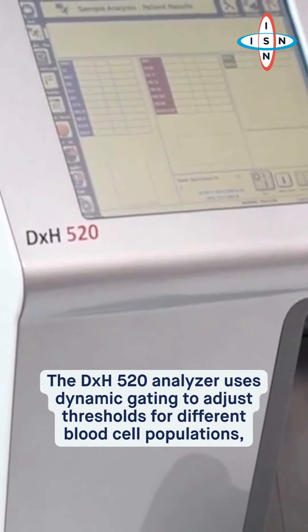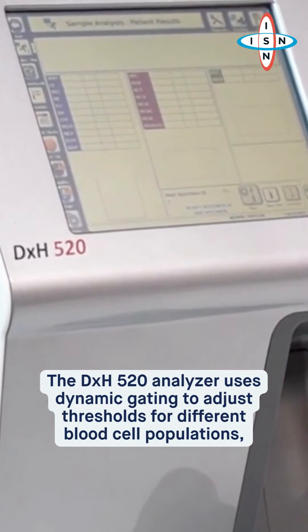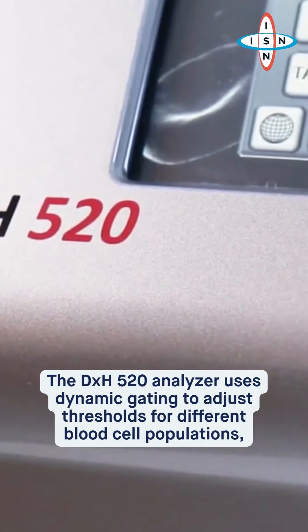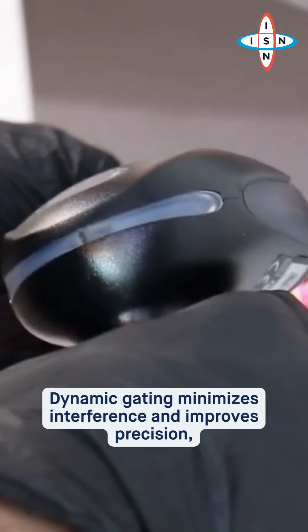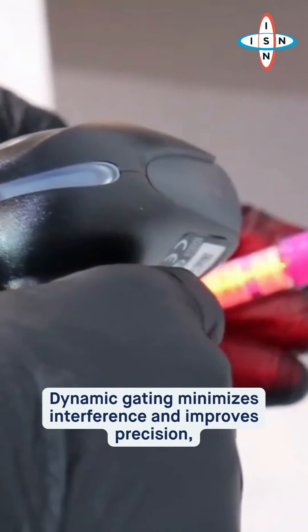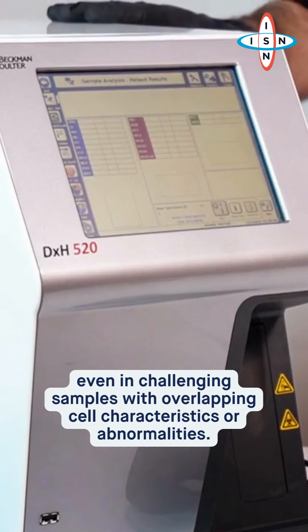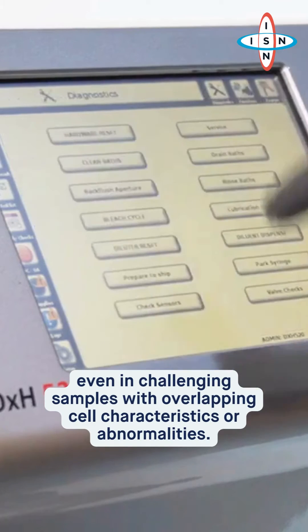The DXH-520 analyzer uses dynamic gating to adjust thresholds for different blood populations, ensuring accurate separation and counting. Dynamic gating minimizes interference and improves precision, even in challenging samples with overlapping cell characteristics or abnormalities.